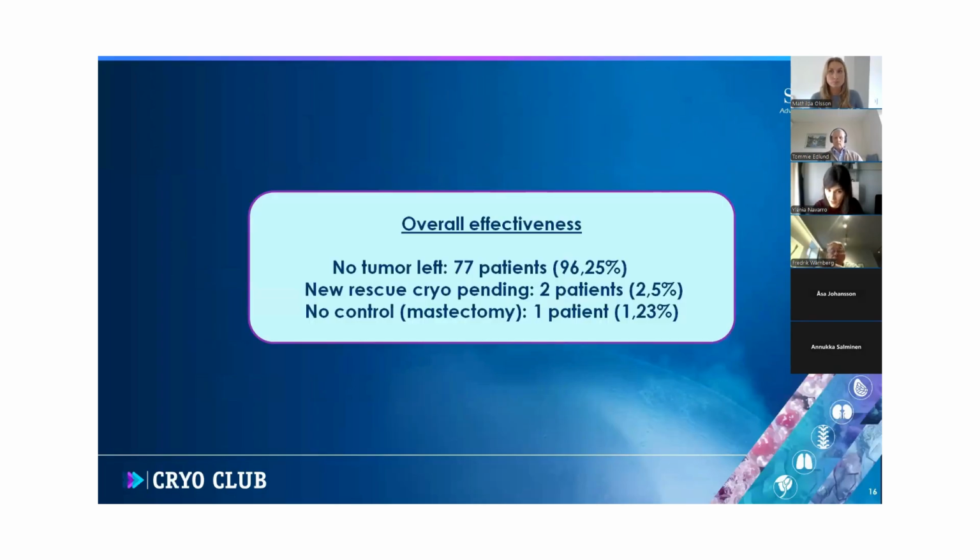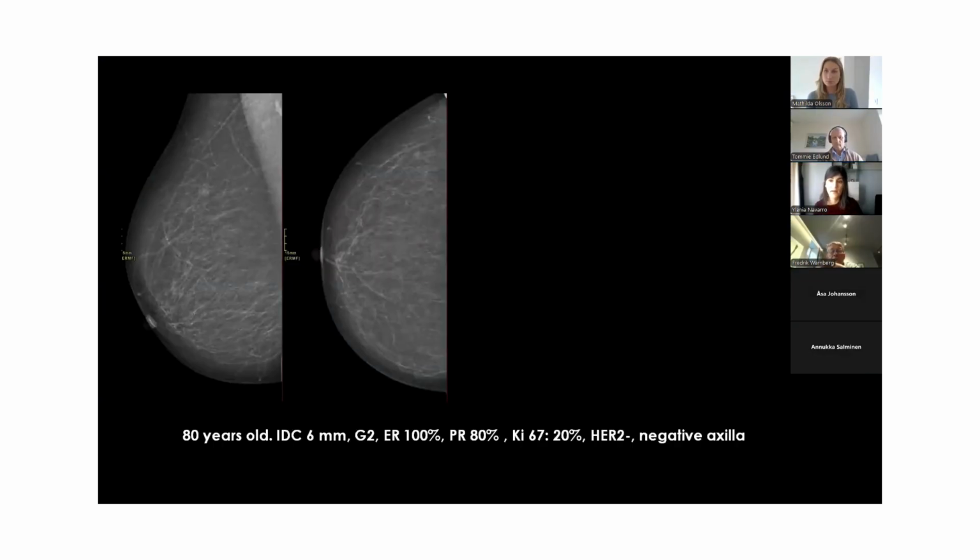So overall effectiveness, there was no tumor left after cryoablation in more than 96% of the cases. So this shows this is a very effective, very useful treatment for this group of patients. And we could not control the disease in only 1%. Now let's see some very interesting cases.